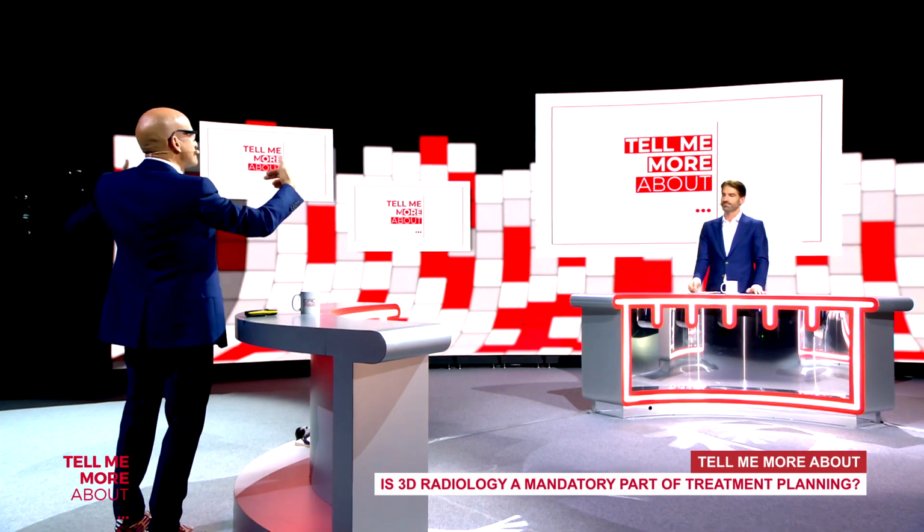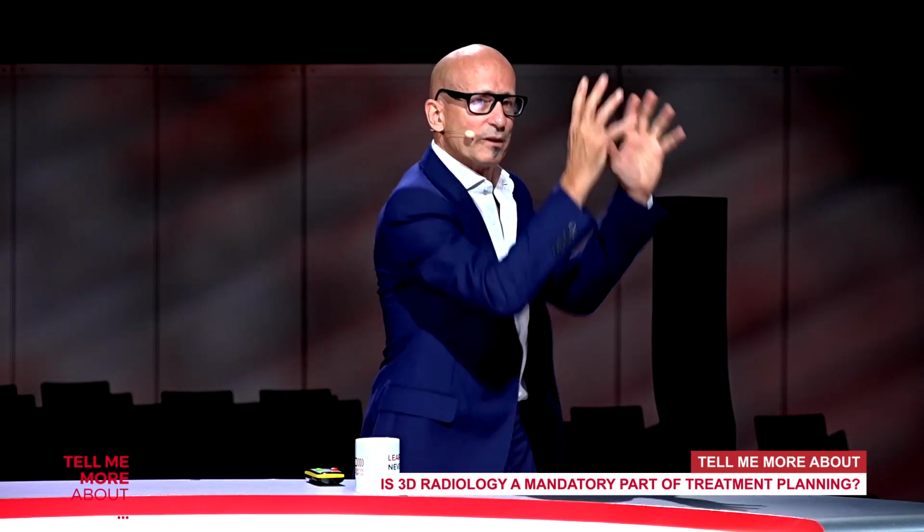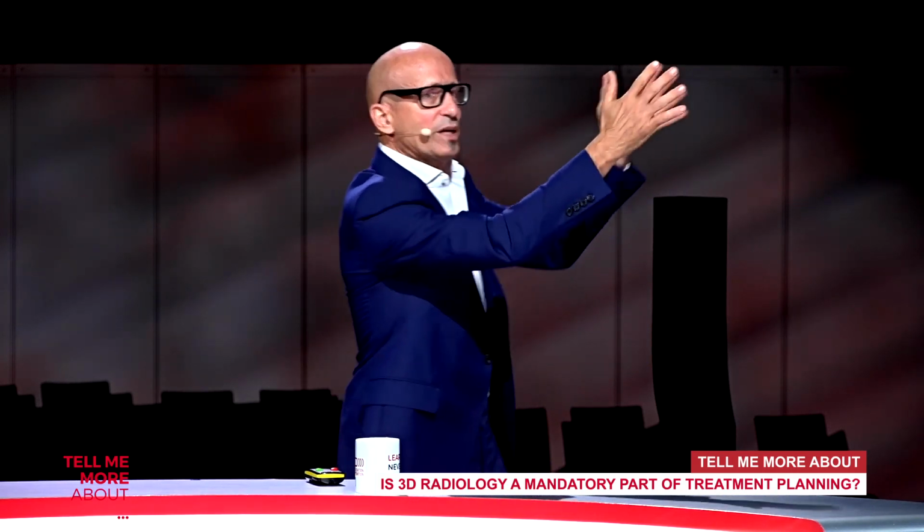Because I had to do a static planning to create or to drill or to print my template. So I had to do all the planning in the software, and I have these pictures on the screen beside it. And then I can compare my static planning with the monitor, and then I know where I am. I need it there, for sure.